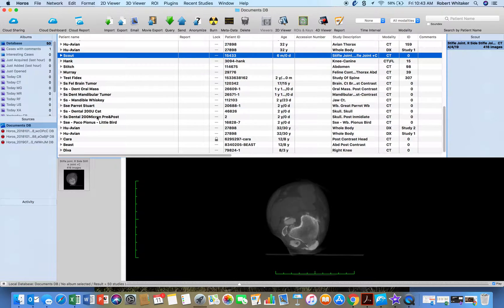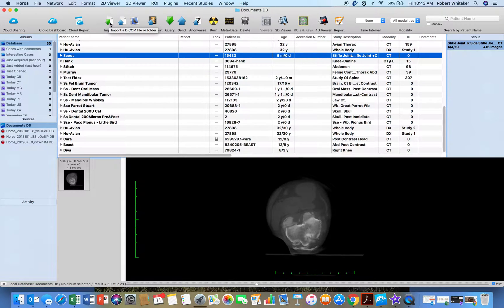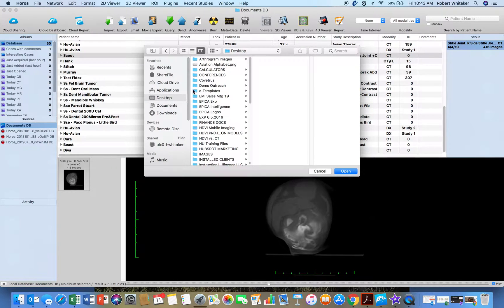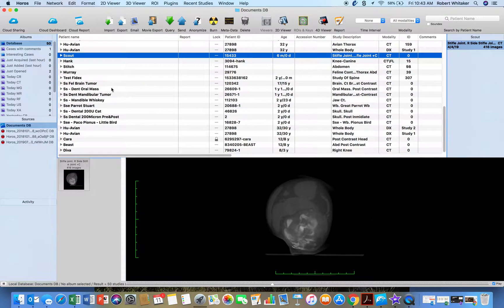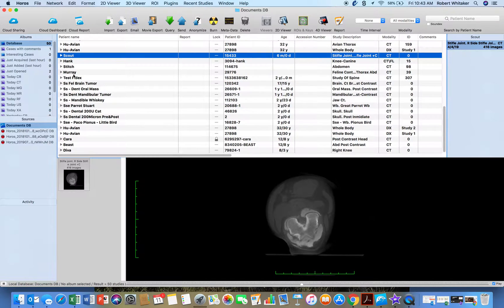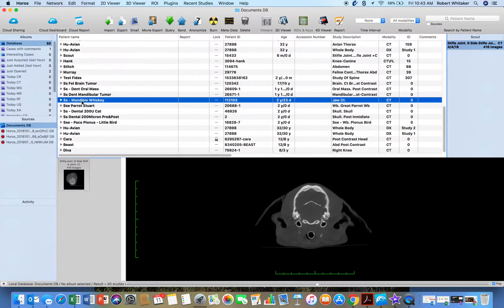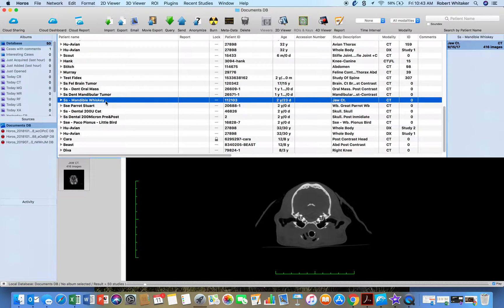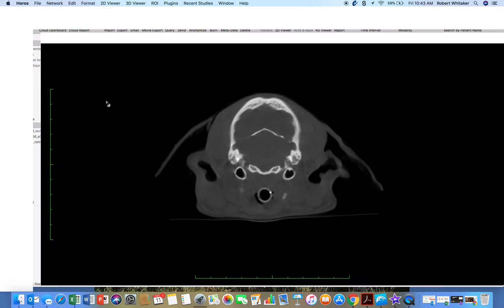And if I want to import a study from DICOM, I'm going to use this import and then choose the file. But we get cases here. I have a dental scan here. Double click.